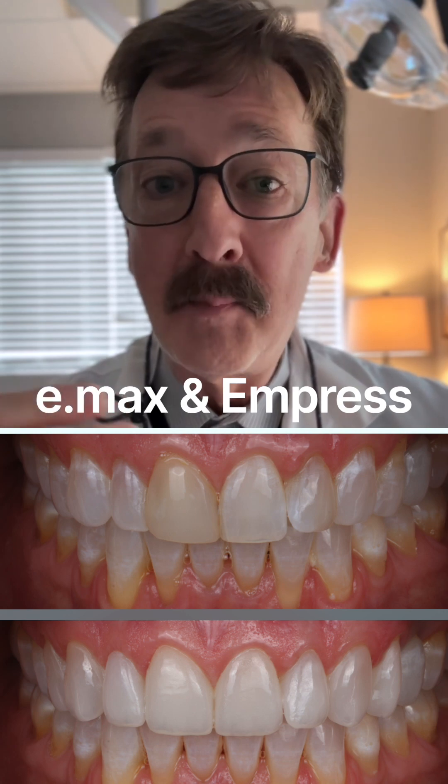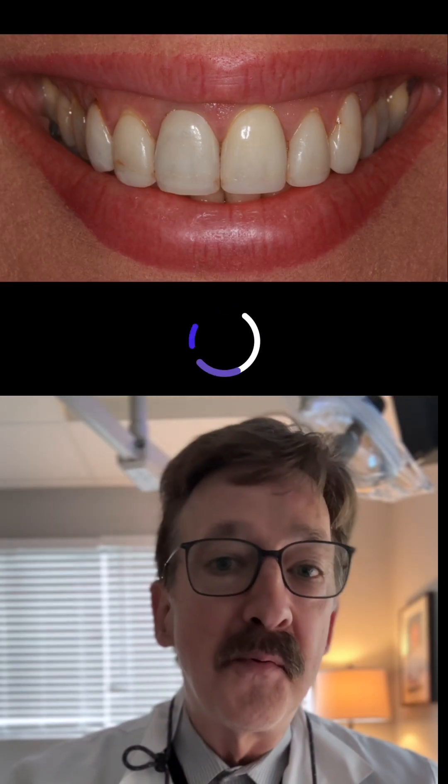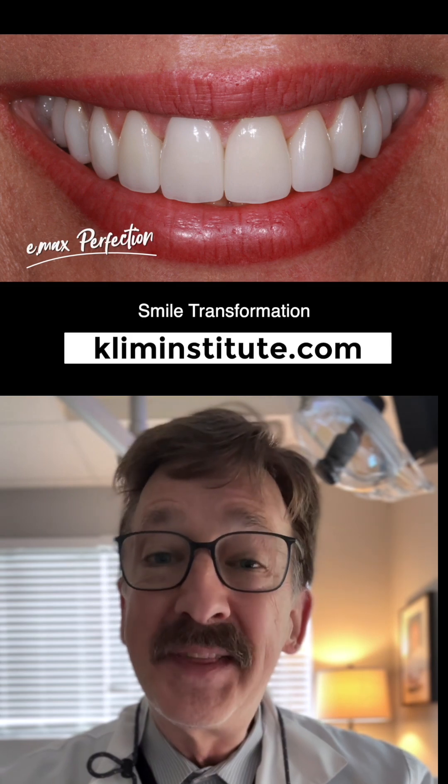I use Exocad to do my wax-up — I'll share a little bit about that. I also love good ceramics; I go through my ceramic preferences and how I choose to shade. I love conservative preps. If we can go prepless, we can do that, or really minimal preps. I'll go through that and then the fabrication process, particularly with the software.